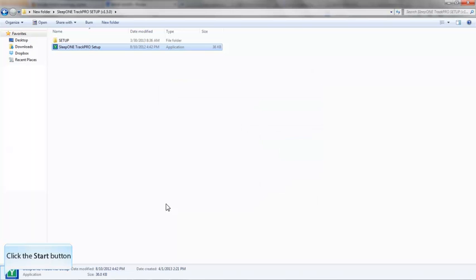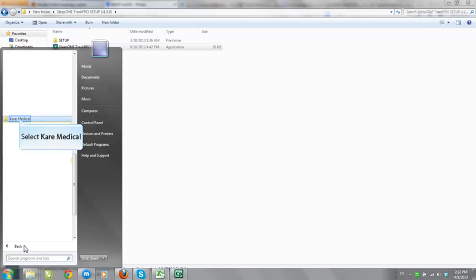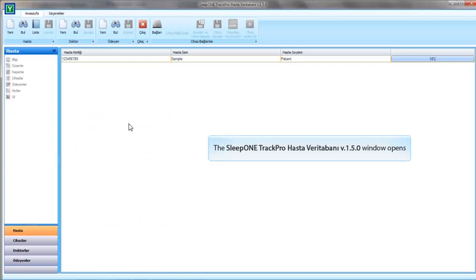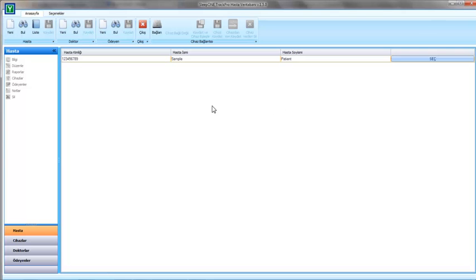Now let's open the Sleep One Track Pro Application. Click on All Programs. Select Sleep One Track Pro Patient Database Shortcut. Main Application window will open. If the language is not English by default, you can change it by clicking to the upper tab, then selecting English as Language.